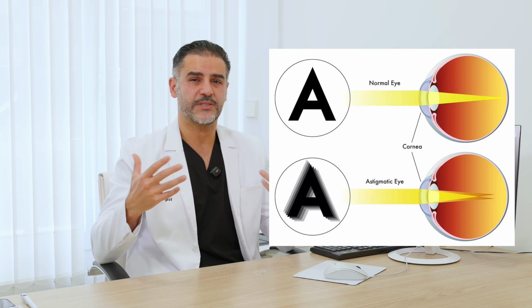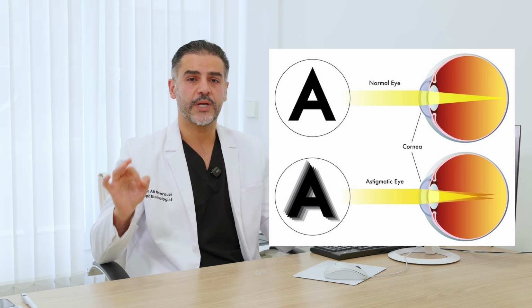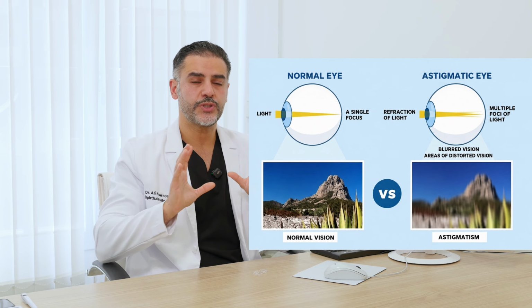lenses. When we have corneal astigmatism in a study before surgery of more than 0.6 or 0.5 diopter, we would decide to choose toric lenses to correct the astigmatism, beside the myopia (nearsightedness), hypermetropia (farsightedness), and presbyopia, in the same approach to deliver the best visual function and visual quality to our patients.